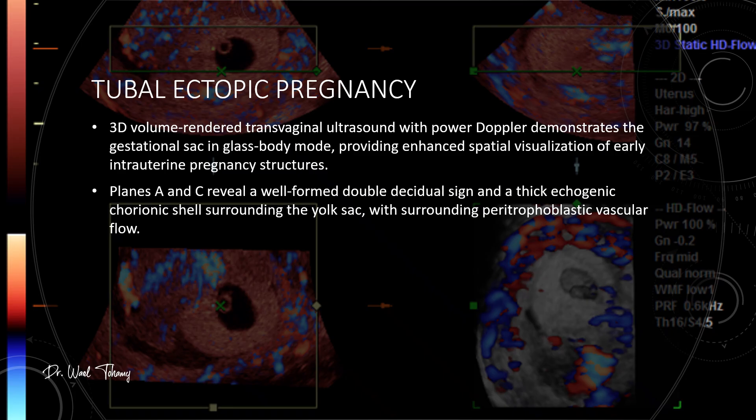Here is a 3D volume-rendered transvaginal scan using power Doppler displayed in glass body mode. This mode enhances spatial visualization and you can really appreciate the relationship of early pregnancy structures. In planes A and C, you will spot a well-defined double decidual sign and a thick echogenic chorionic shell surrounding the yolk sac with peritrophoblastic vascular flow wrapping around it. 3D glass body mode isn't just pretty imaging — it's a powerful tool for confirming structural relationships and differentiating between intrauterine and ectopic gestations.